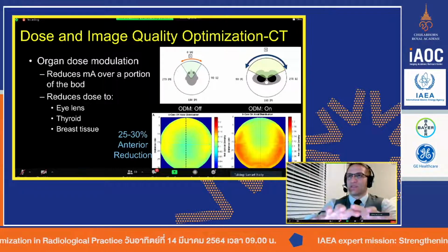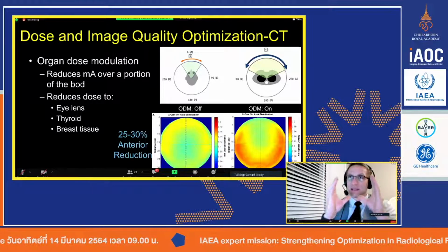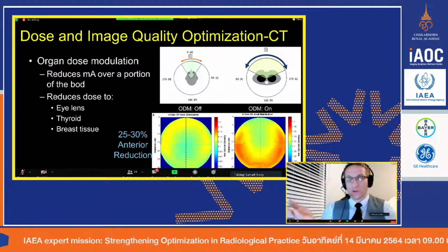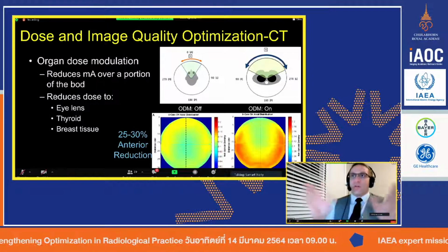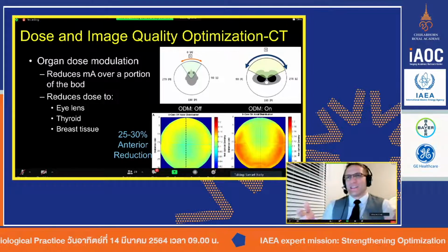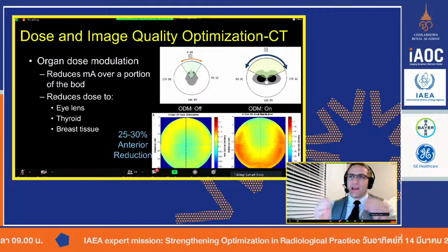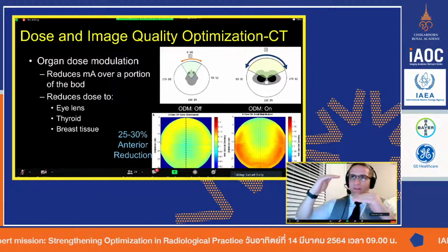And so the system will set up what's called a dose notification window. And it'll say, hey, by the way, this scan you're about to do is going to be higher than normal. Do you want to go forward? And then you would say yes or no. If you go, oh, I did something wrong, you can back up. Maybe I accidentally put 120 kV and it was supposed to be 100, whatever happened. So that happens prospectively.